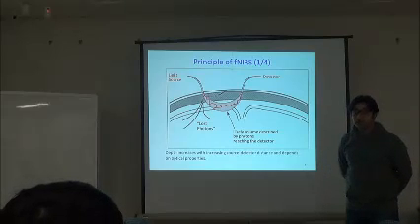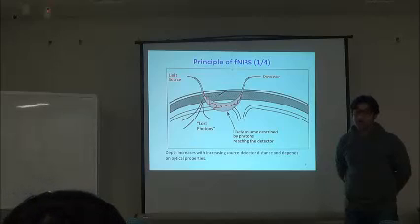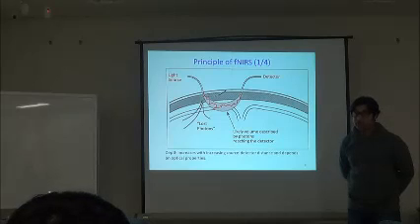Yes, of course we can do that. But the problem is that if we have a very high power, they can actually damage our tissues. Even if it is just near infrared light? Yes, of course it can.